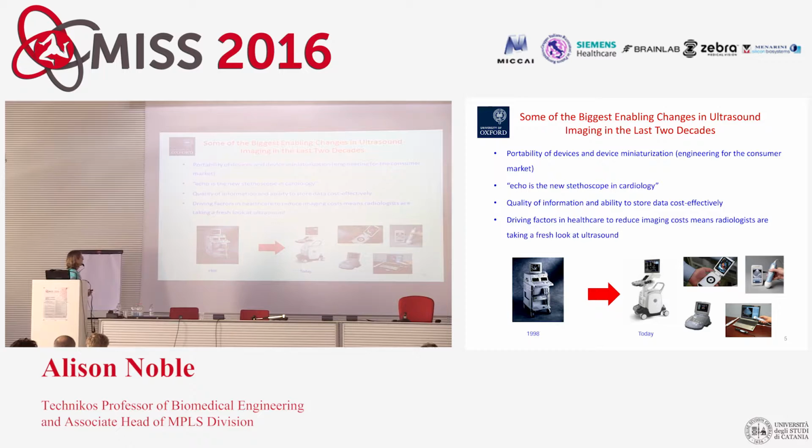But what continues to happen since then, which I think is a bigger influence on our field, you might even be surprised at, because we normally talk about image quality being really important to the image analysis we do. But the biggest change is in terms of the portability of devices.